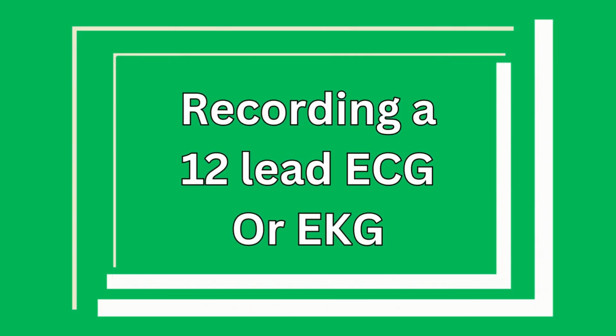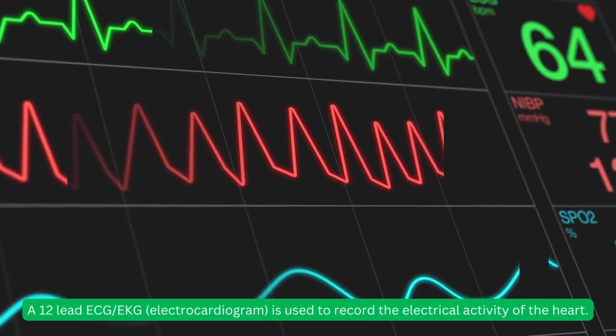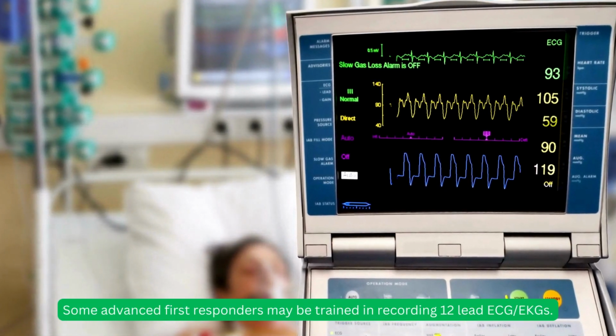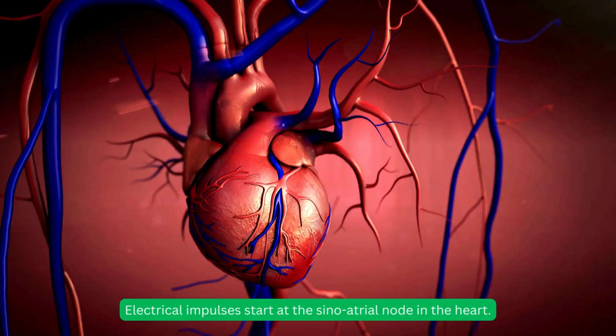Recording a 12-lead ECG or EKG. A 12-lead ECG or EKG electrocardiogram is used to record the electrical activity of the heart. Some advanced first responders may be trained in recording 12-lead ECGs or EKGs.